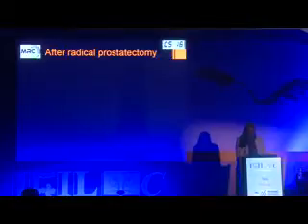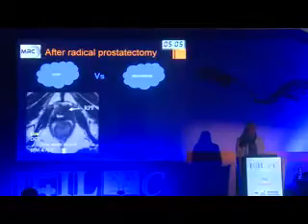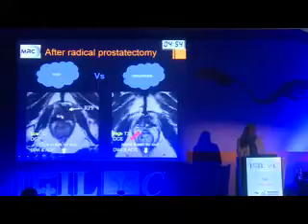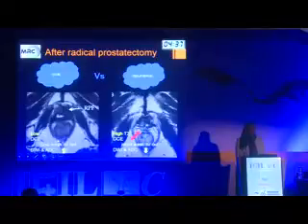How about treatment? After radical prostatectomy, we have a concern about whether there is a residual tumor, a recurrence, or a scar. MRI can nicely assess these entities by assessing their morphological appearance on T2 weighted images and also the functional data, as we can see here in this example. This patient has had a total radical prostatectomy, showing heterogeneous signal at the operative bed. We can't know if this is a residual tumor, recurrence, or just a scar. But the very low signal here is more indicative of a scar, and also this lesion on the ADC map shows a high value.